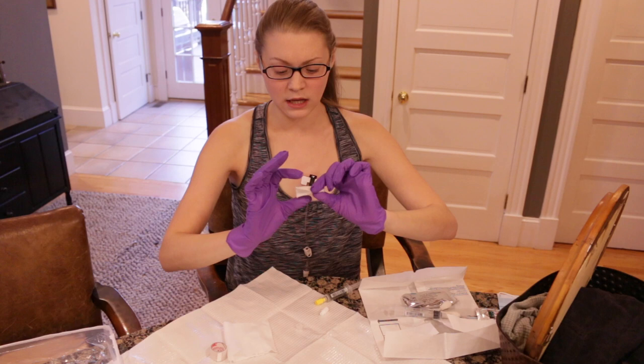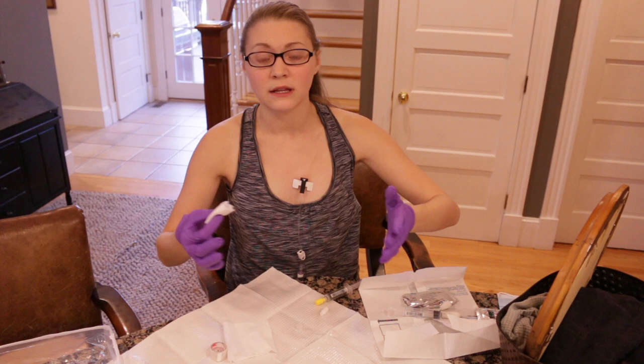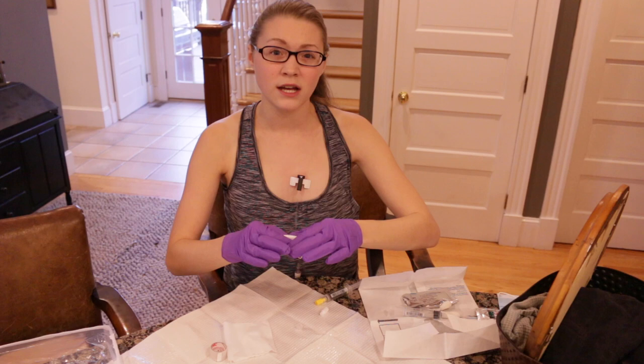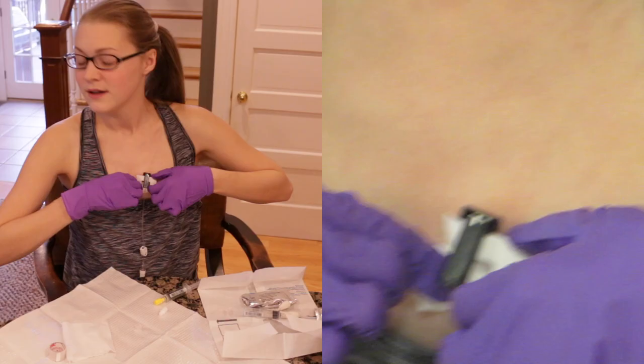My chest and my needle are still sterile, so I'm good to go ahead and adjust it how I want it. Remember to talk to your care team about what is good for you and your port. For me, I do not let the gauze touch the needle insertion site — I just feel more comfortable if it's down slightly. When I'm breathing, I'm just looking away so I'm not breathing straight on it, and I hold my breath when I look down at it.